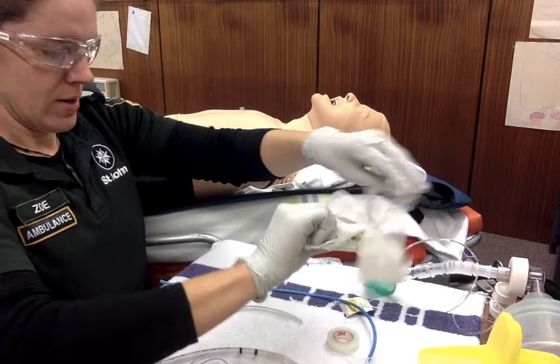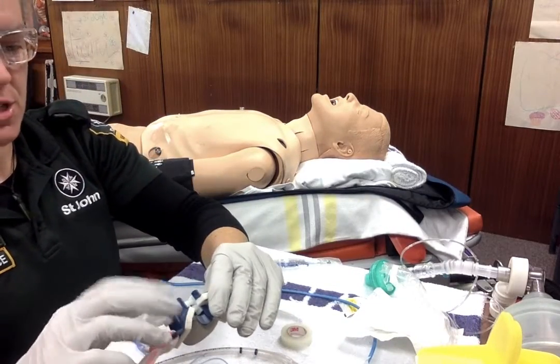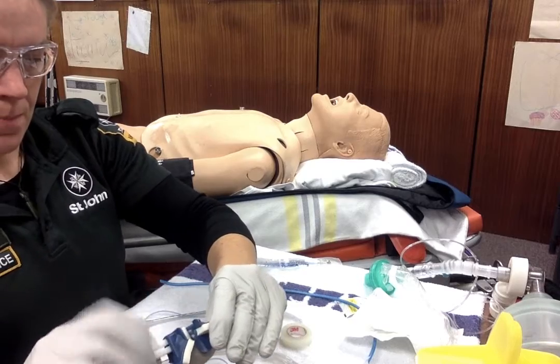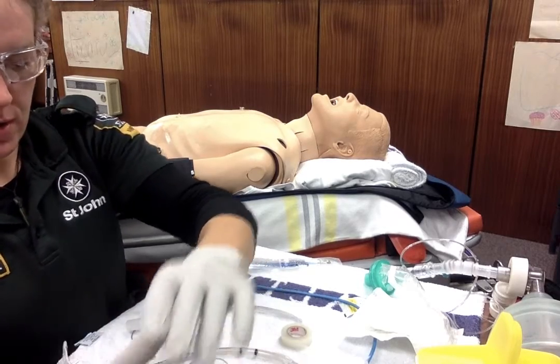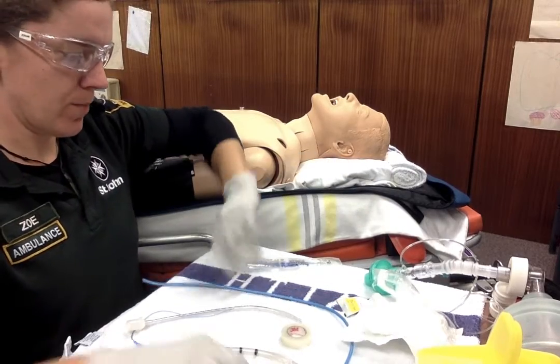Some options are tape. Some people have mentioned using a paediatric Thomas tube holder or a tube tie, which I don't have, which I think I would probably go for.